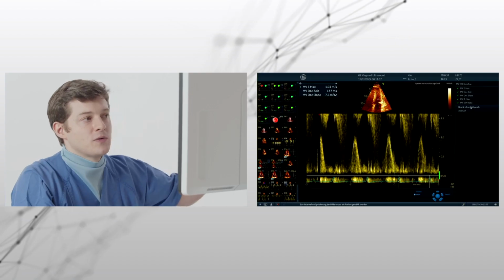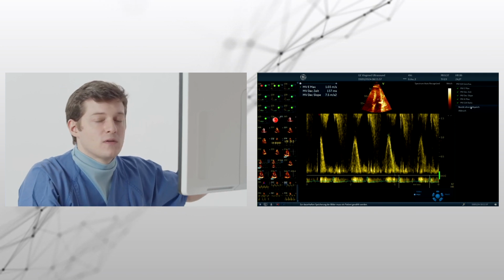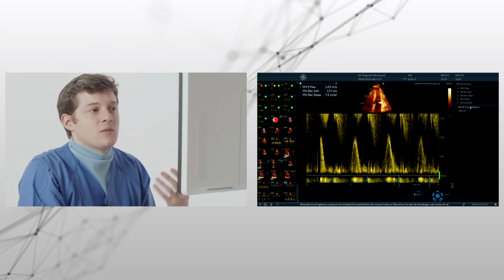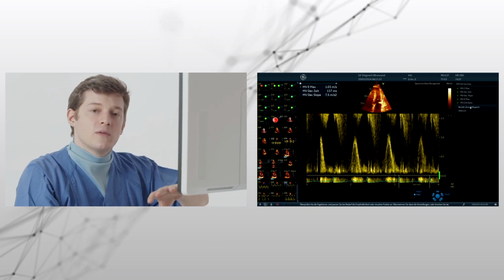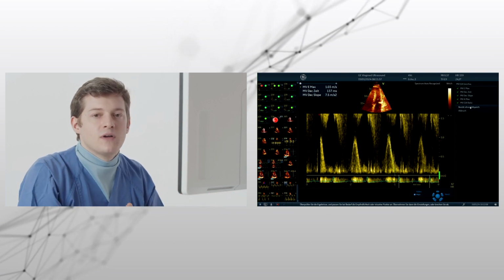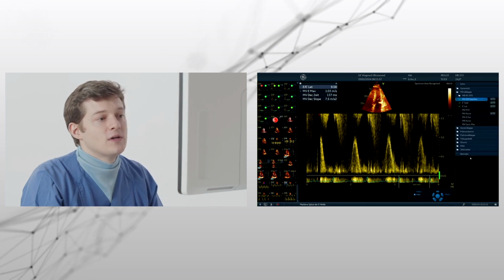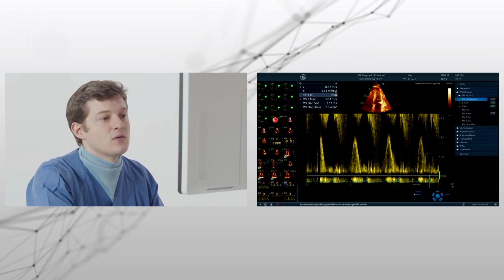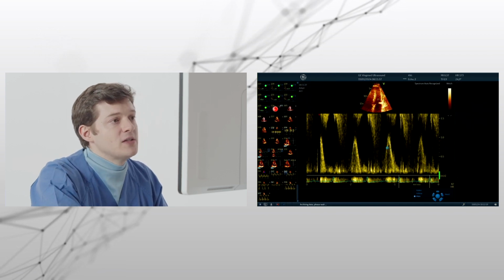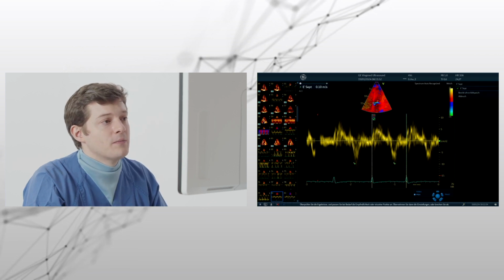So below 150 milliseconds is most likely showing elevated filling pressures, which you also see in the left atrium, in the left atrial strain. So it's definitely some fibrosis there. But when we compare it with the clinical status of the patient, he was telling us he's doing way better and he's, for his situation, fine. So I wouldn't overinterpret, but now we know how the measurements look like, and we can of course also use it. Then we continue with the E to E prime, and the E prime septal.